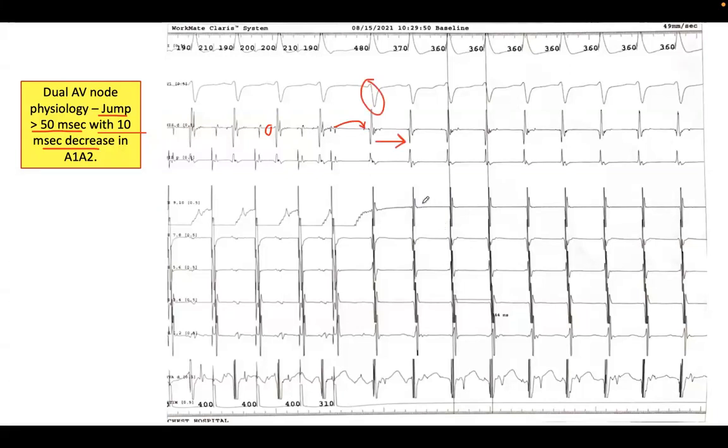I want to say long. Why do you want to say long? So this is your V, right? Okay. Yes. Where are your A's? These are your A's, right? Okay. Yes. Good. This is your V and this is your A. They are almost... okay, it's very short. Yeah, it's very short. Okay. Very short.